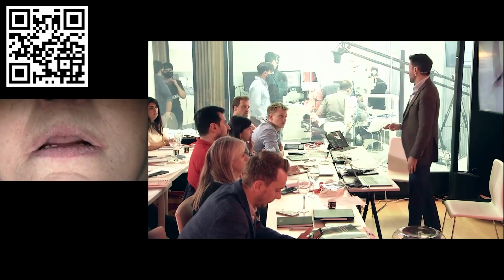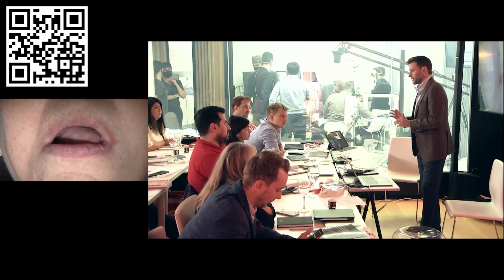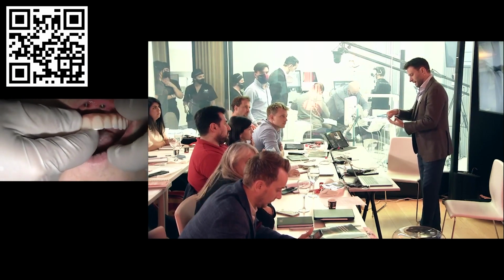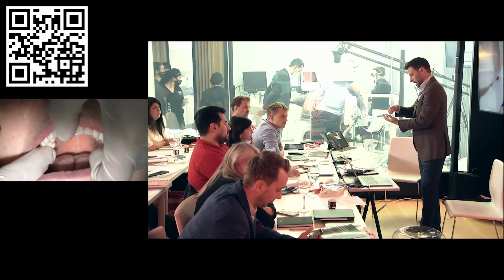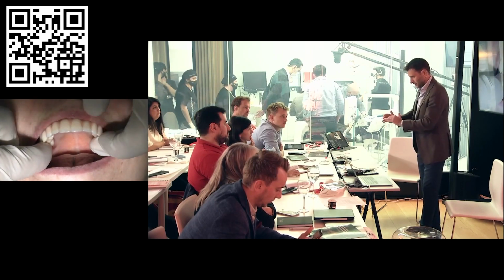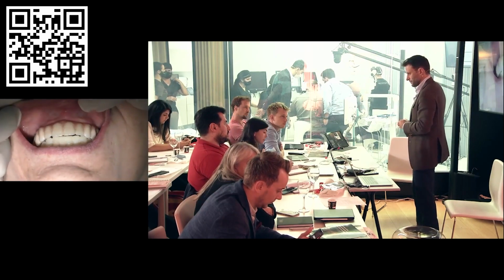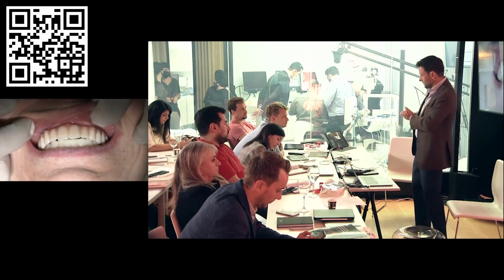Yes, so the bar inside the mouth, according to Angelo, is not mandatory, because he has the information that he already has from the case, plus the scan that you're going to do from the arch without the bar, plus the scan underneath, he technically can match. But sometimes if the tissue is kind of covering here and there, he is recommending the dentist to play safe and scan the bar in the mouth as well. Okay? So he can work without this file, but he's saying that it's safer to have the file.